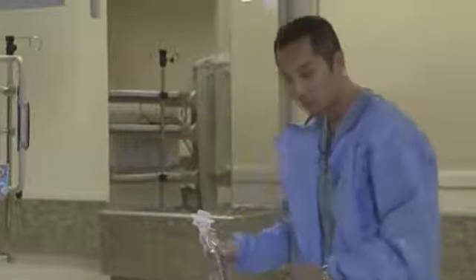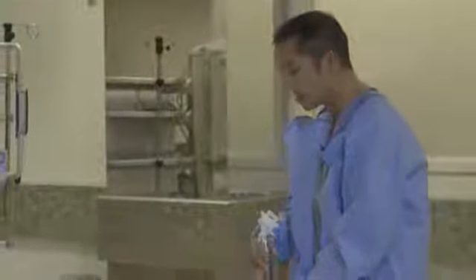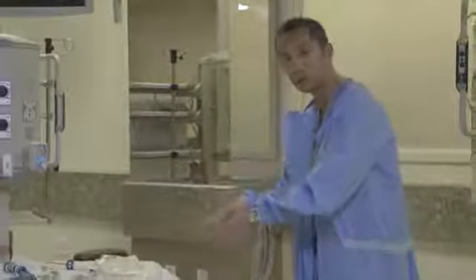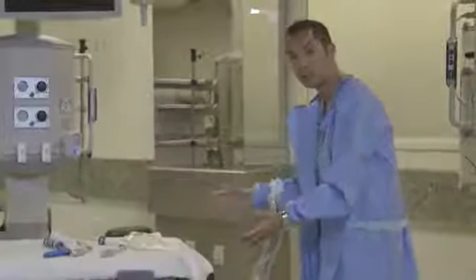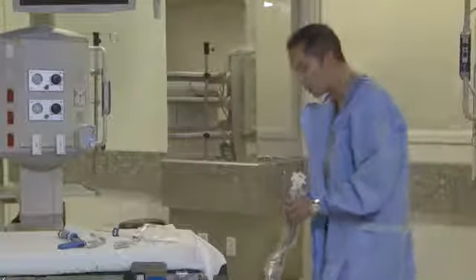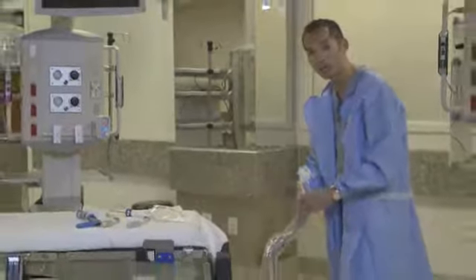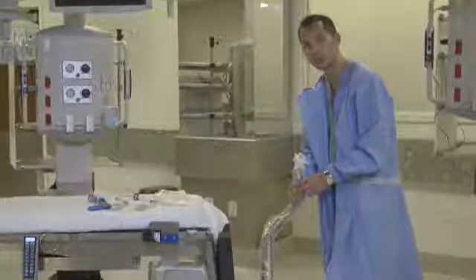And as I said before, one of the things that you're going to want to do is, as you get ready to go ahead and put the rest of your drapes on and get the patient set up and the operative field all prepared, you can certainly just pull this out of the way to keep it from obstructing any kind of view or access to the patient until you're ready for it.